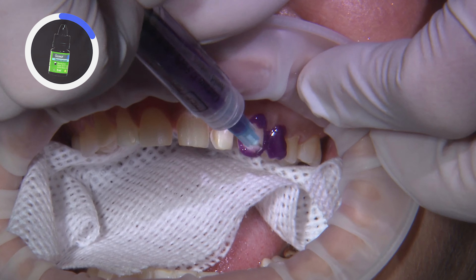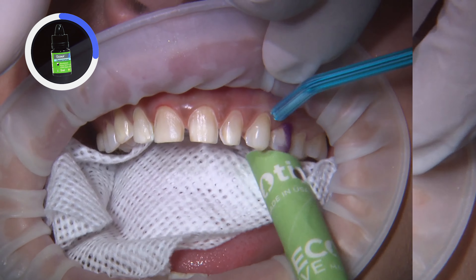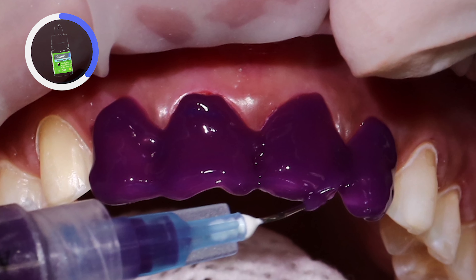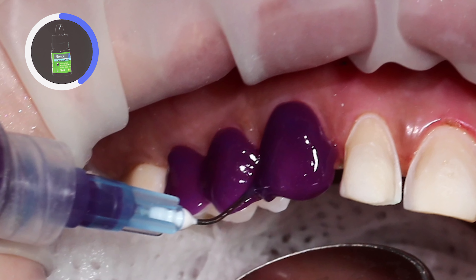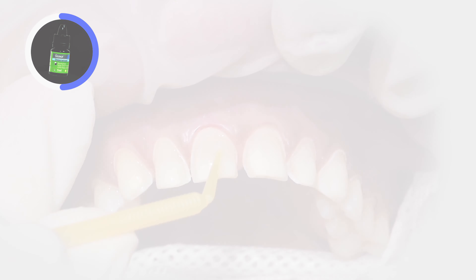Now we're on to the final delivery, and we need to ensure that the temporary material is completely removed. The temps can be somewhat tricky to remove since they were bonded in. Here I use a slow-speed carbide round burr to facilitate the removal of the bonded acrylic and ensure we reach the preparations beneath.